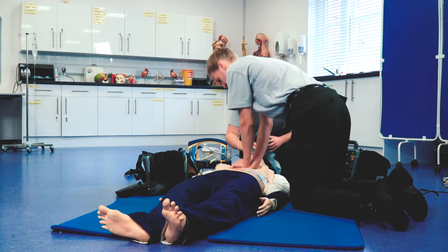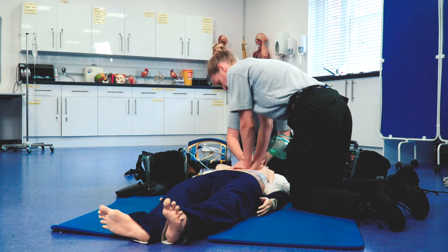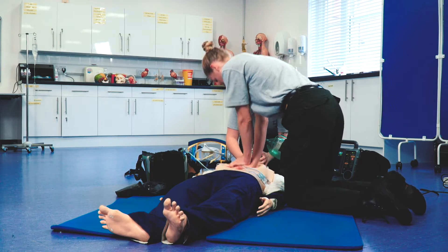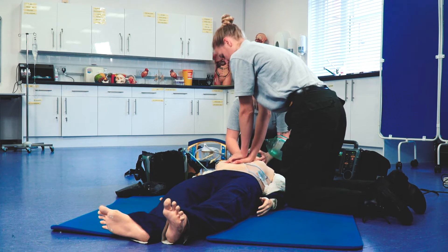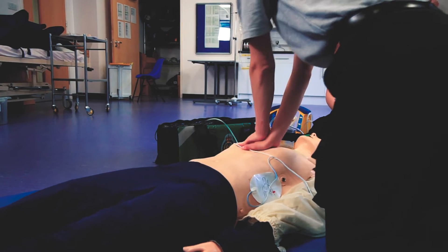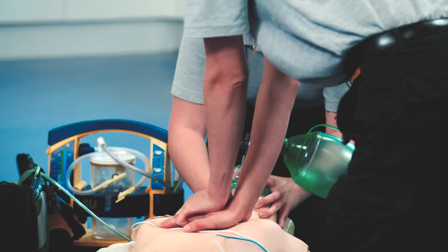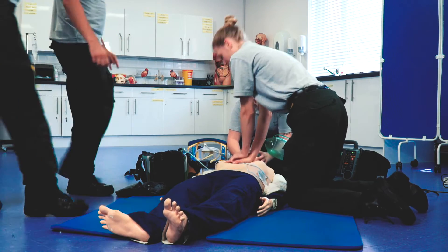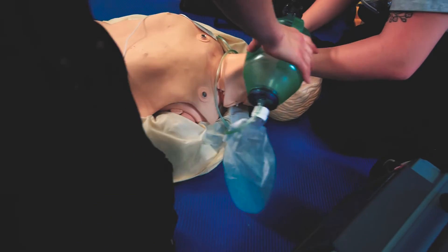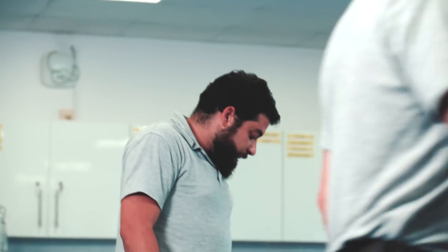I'm going to do a double-E grip if you wouldn't mind. Just wait for that second crew to turn up. Three, two, one. Ventilate. I'm being sure not to over-inflate the lungs. You're on your second cycle. If the second crew don't turn up then we'll just continue. Hi guys. The history we've got: this is a 50-year-old male who went out running and collapsed in the park. I'm going on to my fourth cycle. After this we'll do a rhythm check and someone take over from me.